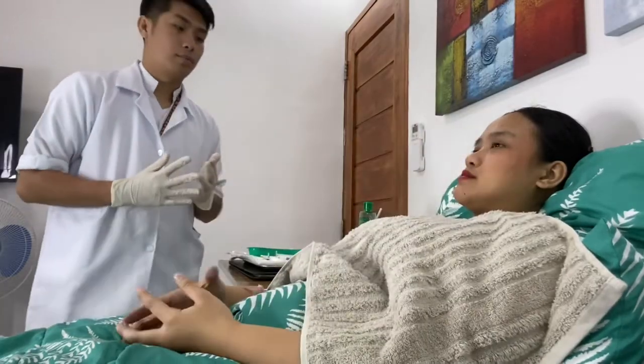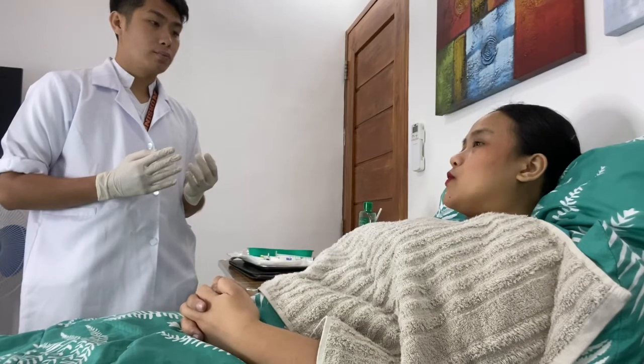Okay, ma'am. Prepare the tube. Ma'am, I'm gonna prepare the tube before we start, okay? Okay.